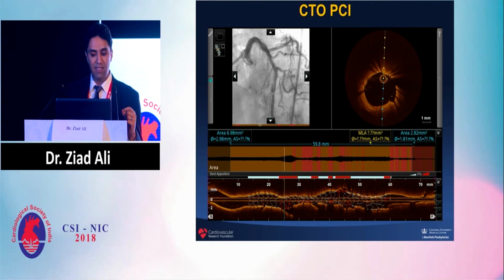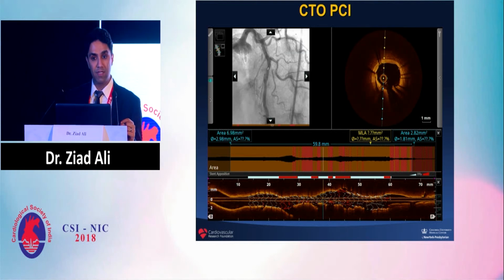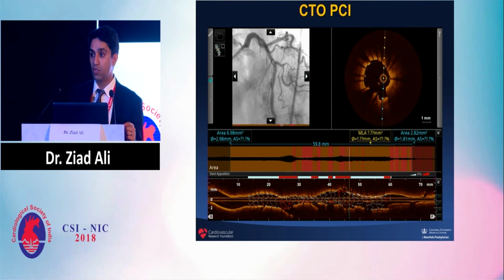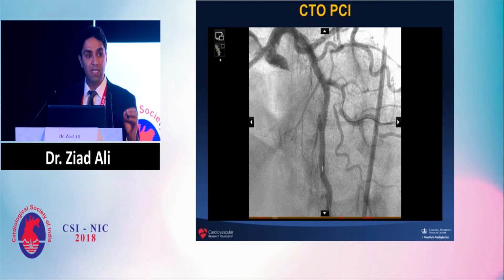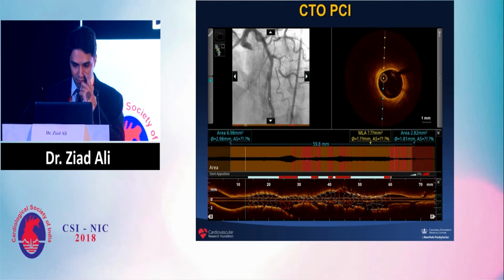But the OCT in this situation also tells us not to perform any more therapy, as there's a large aneurysmal segment in the subintimal space, and high pressure post-dilation in this position could be problematic, and as a result, the patient was discharged and brought back 3 months later for optimization of the stent.